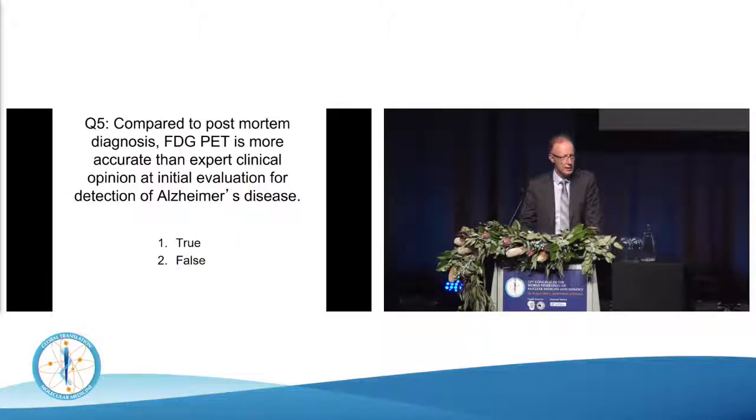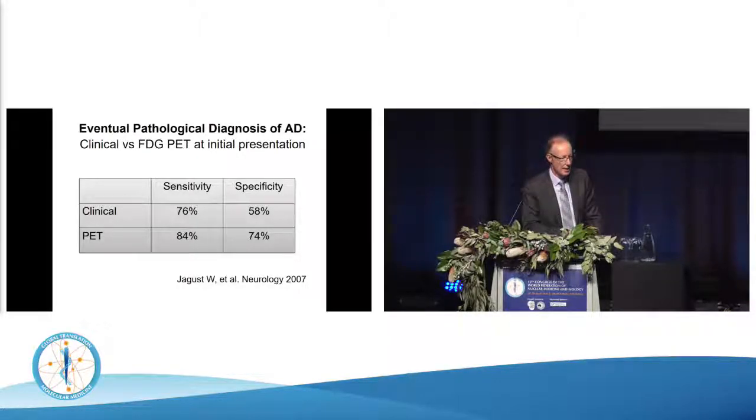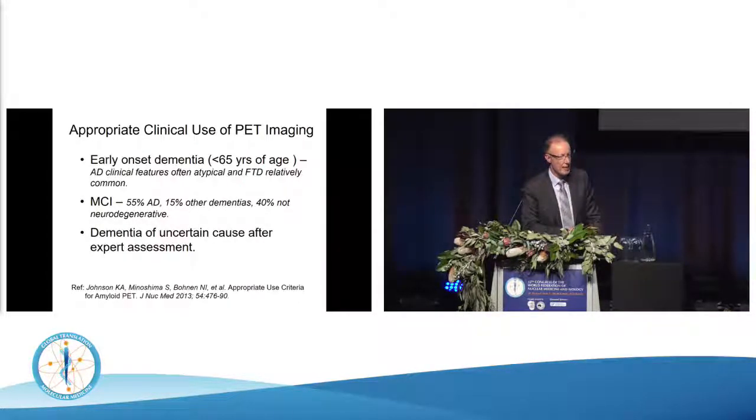Compared to post-mortem diagnosis, FDG PET is more accurate than expert clinical opinion at initial evaluation for detection of Alzheimer's disease. True? Okay, correct, as I showed earlier. The post-mortem studies do support this, and this is that post-mortem study.